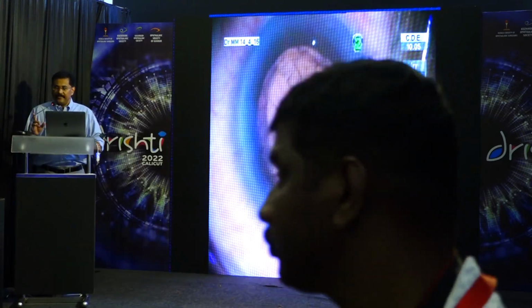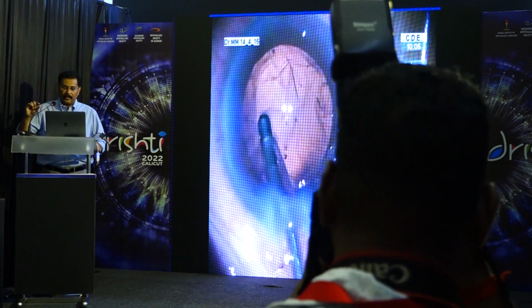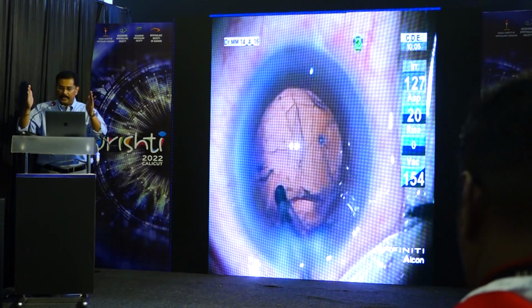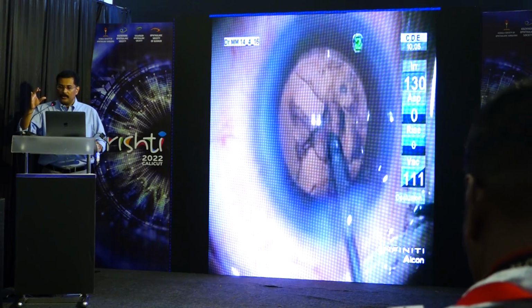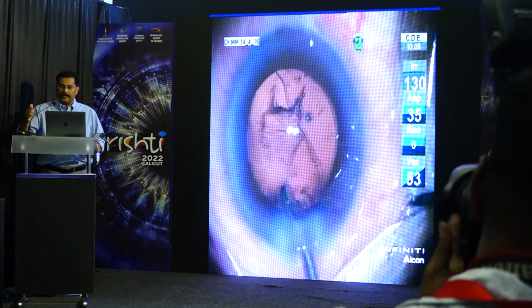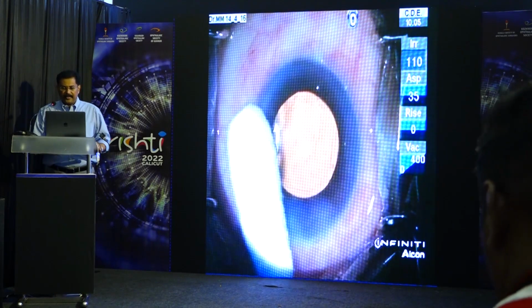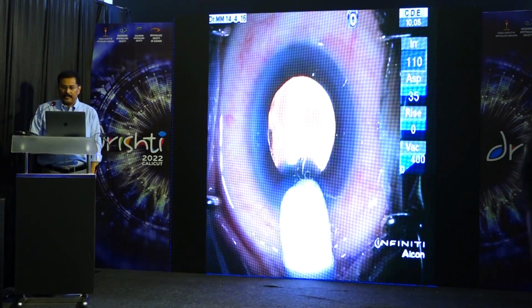Cortex aspiration is a little different because it cuts through the anterior. When we have anterior and posterior offset, you get cuts through the anterior cortex also. So when it cuts through, you'll get a vertically cut edge of the cortex, and you don't have loose cortex to pull it. So if the pupil goes down, then we have to be very careful to go underneath the rhexis margin and aspirate. So careful not to catch the cortex, the capsule here. IOL implantation is fine. It looks very well centered and nice, and that is a major advantage of this.